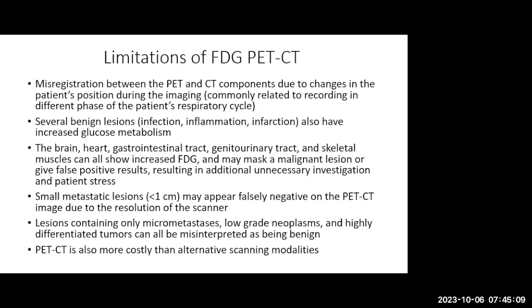And then I just want to quickly highlight some of the limitations. Like everything, we have limitations. You may have misregistration between the PET and CT components of the images due to patient motion or even breathing, right?